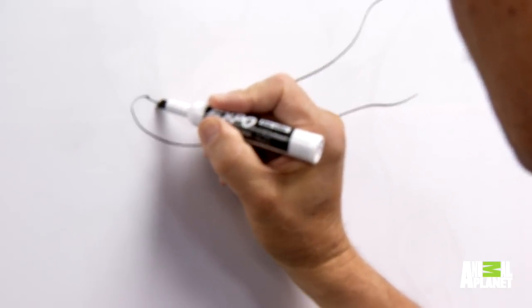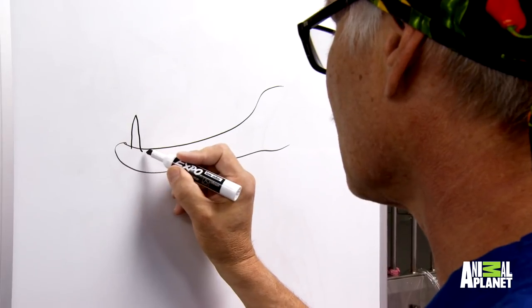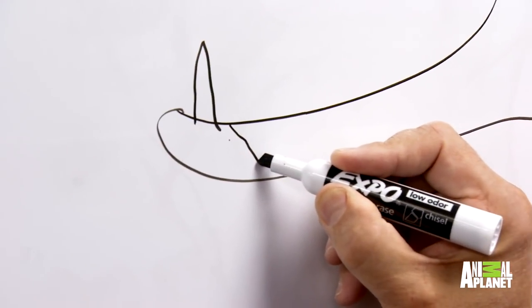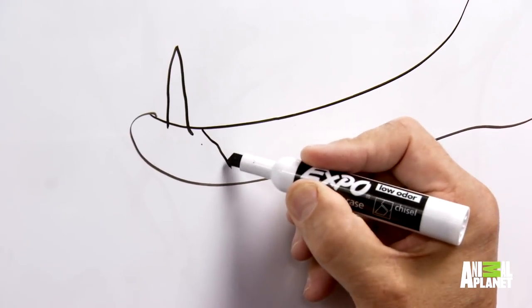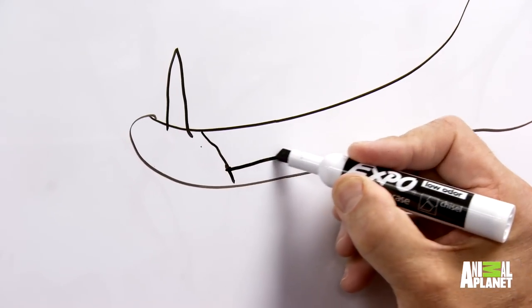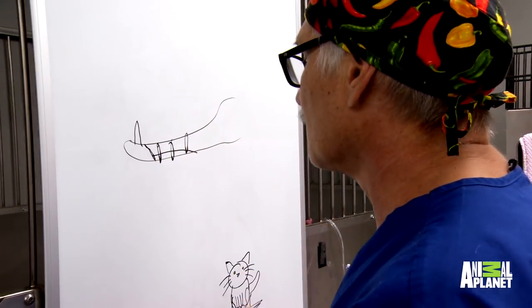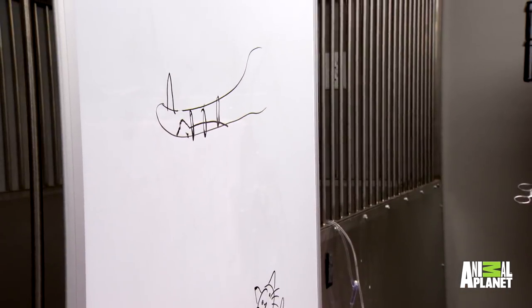The canine is out here, basically cracked through like this, and it's also a really long oblique fracture. My goal is to go in and put a couple of wires here — two or three wires around this — and we'll see how that stabilizes it.